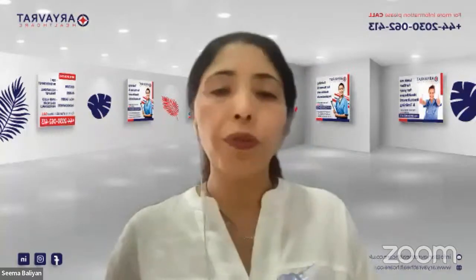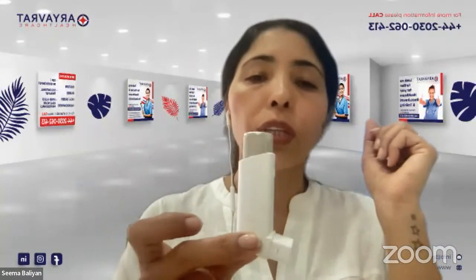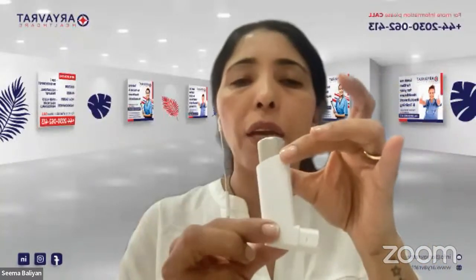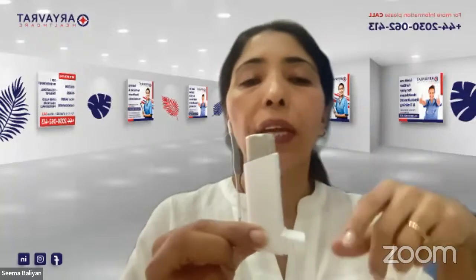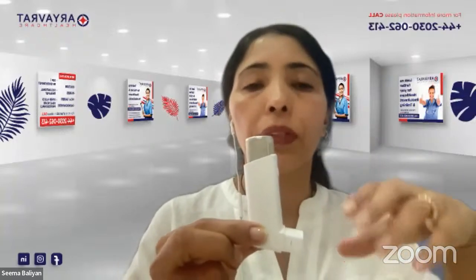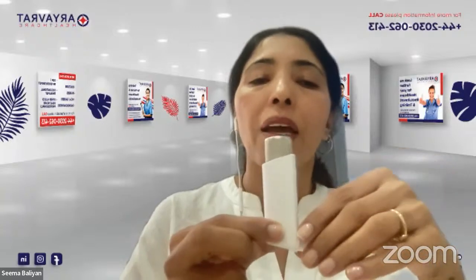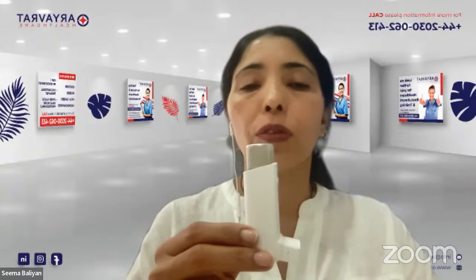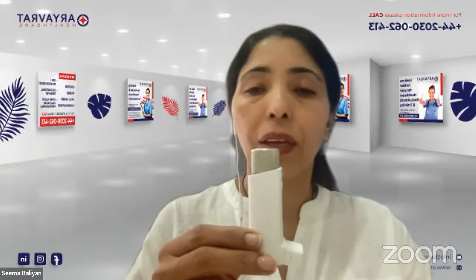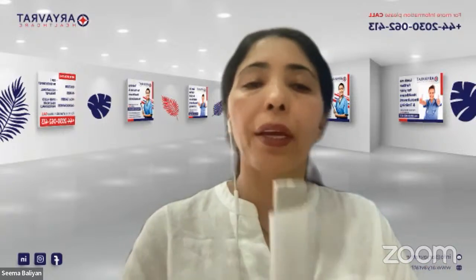So if I show you, this is basically what an inhaler looks like. Depending upon the type of inhaler, it can come in different colors. The blue inhaler is normally the one which contains salbutamol medicine, and the brown is the one which is used for beclomethasone, which is a steroid inhaler. So in your exam, you are going to get a salbutamol inhaler.